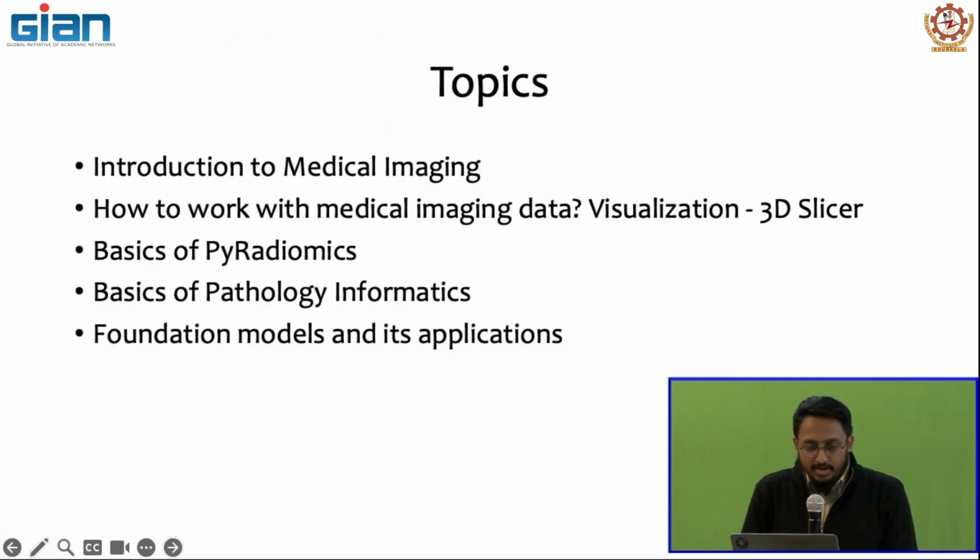And then we'll look at the basics of Radiomics. This is a package that you will be using through Google Colab. Using your web browser, you can use Google Colab, and Google Colab allows you to access GPUs from Google servers and run your own code without having to install any software on your own laptop. And then we look at the basics of pathology informatics.